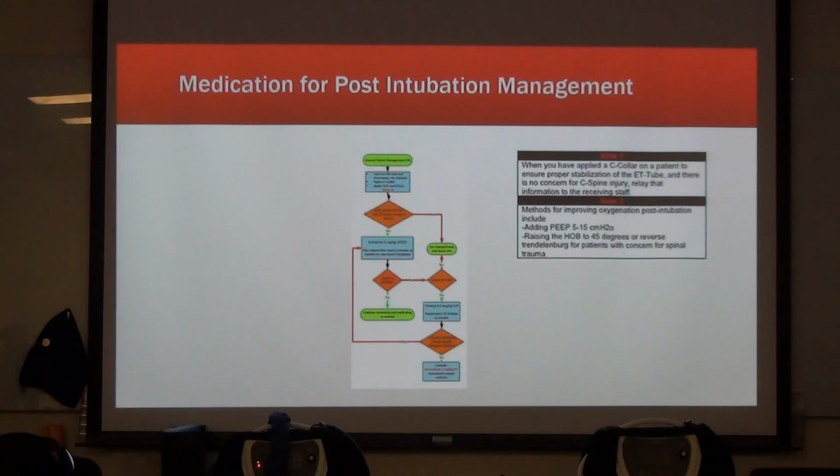You know what's another good indicator of your patient's sedation level? Your alarms. You're more apt to have high pressure alarms with patients coming out of sedation because of bucking the tube, fighting, coughing, or whatever. I can tell you that if you keep them properly sedated, you're going to have a much cleaner report and an easier patient to manage. Yeah, it's a whole lot easier to bag, everything.